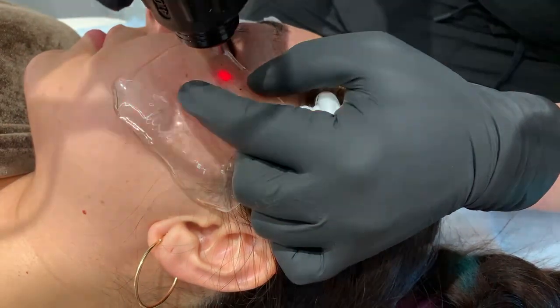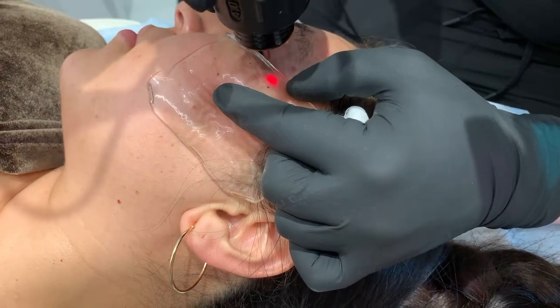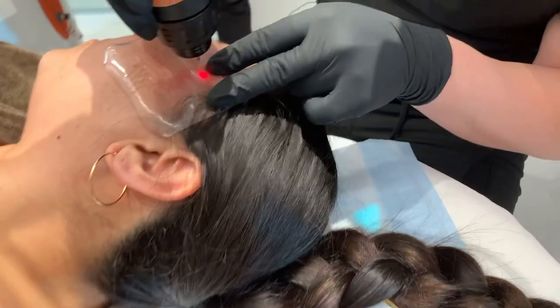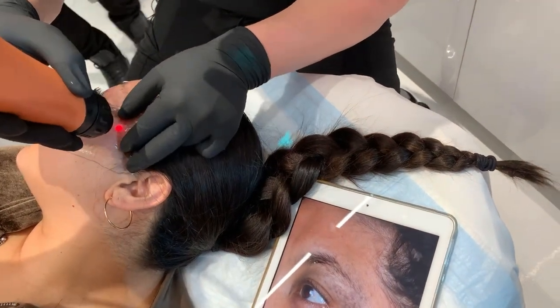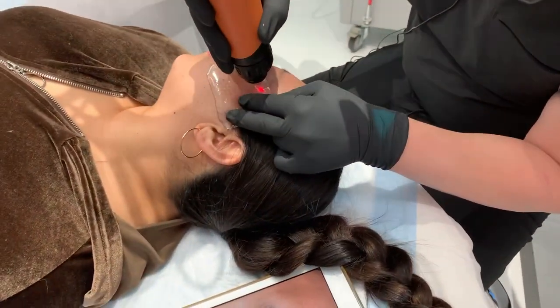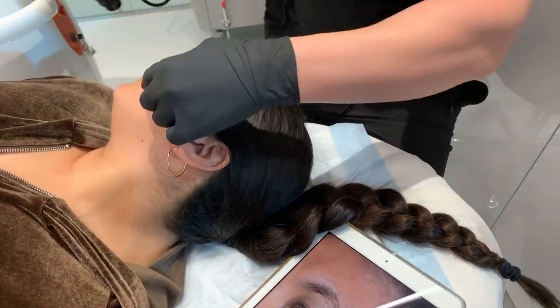Do you do PRP or exosomes afterward? Not for this, I don't think you need it, because this is all internal. But if we were to do lasers, definitely would make a huge difference if we're doing like an ablative or a non-ablative laser, or if you had a wound. This needs growth factors. So my Emer Skin Refit Face was made for this, the peptides, Anti-Age MD, and we use silicone gel, and then you just need exfoliation. So in general, it's following our protocol.